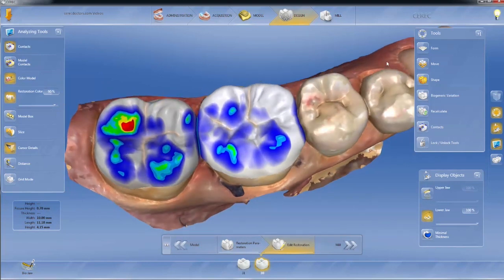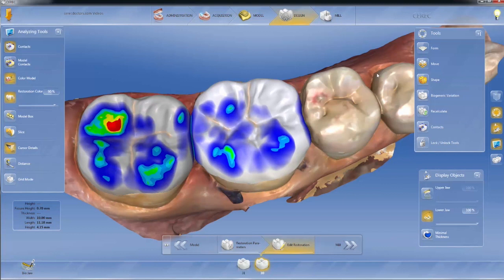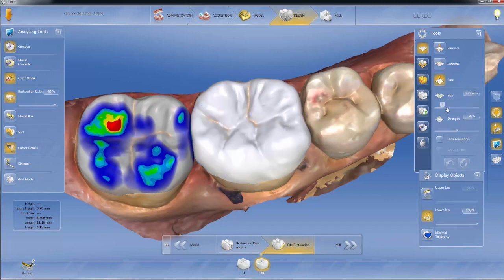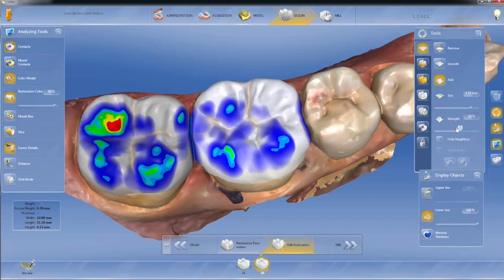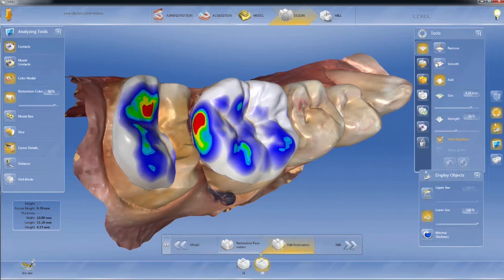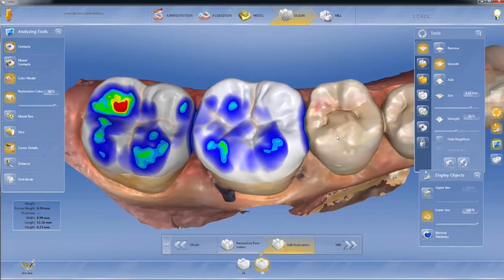If we look at our tools, they are essentially the same. We have the form tool — the tools are available to us and they don't toggle off and on. I can adjust the size and the strength. Any time I'm working on multiple restorations I can hide my neighbor. This applies to the form tool and to the shape tool. So when I hide my neighbor and use the form tool, I can smooth this area out and the neighbor is not in the way.